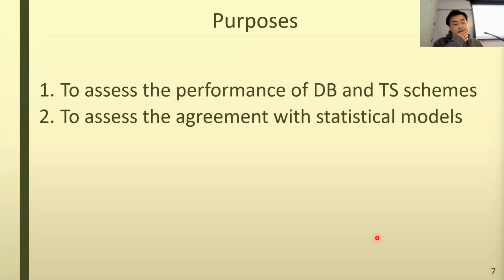All right. So the purpose of this study is to assess the performance of the direct binning scheme and the threshold subtraction scheme, and assess the agreement with statistical models. Because if we want to use any statistical information embedded in the data, it needs to agree with the statistical model we're going to use for the algorithms.